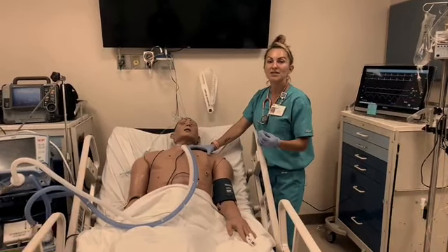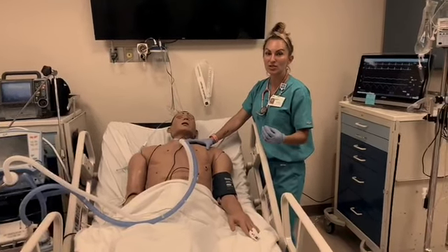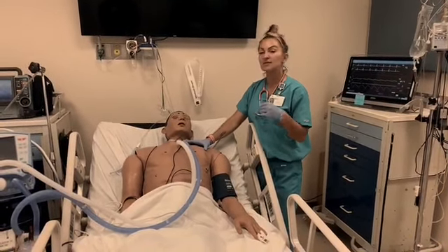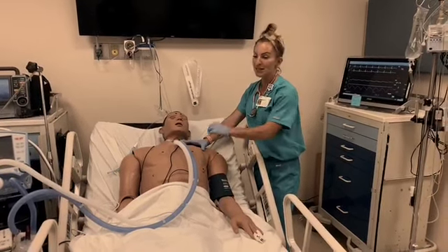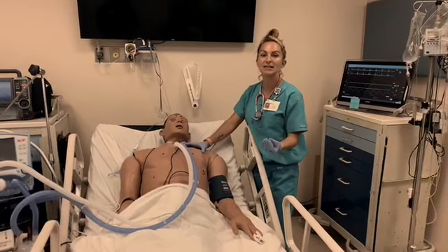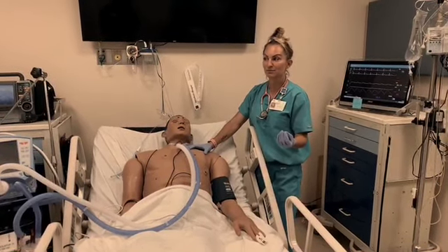For risk for infection, it's important that every 24 hours you perform adequate site care as well as exchange or replacement of the inner cannula. If the inner cannula is disposable, which the majority of the ones here at Mount Sinai are, you will be taking it out and replacing it with a brand new one. If it is not disposable, you will be providing cleaning to that inner cannula and replacing it. Those are some of the late complications for tracheostomy placement.